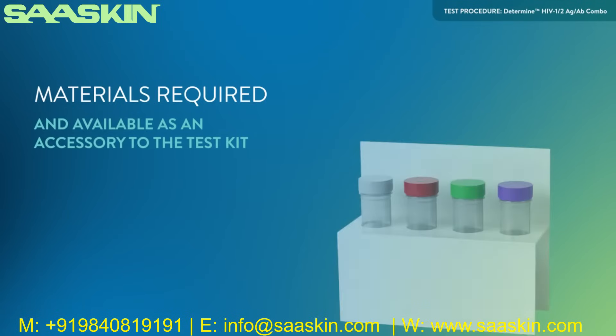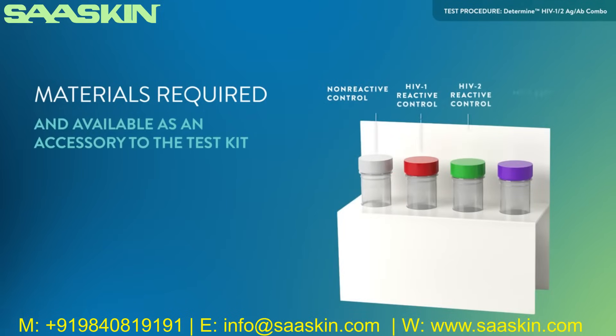Materials required and available as an accessory to the test kit: Determine HIV-1-2 Antigen-Antibody Combo controls. Each kit control box contains four vials: one non-reactive control, one HIV-1 reactive control, one HIV-2 reactive control, and one HIV-1 P24 antigen control.